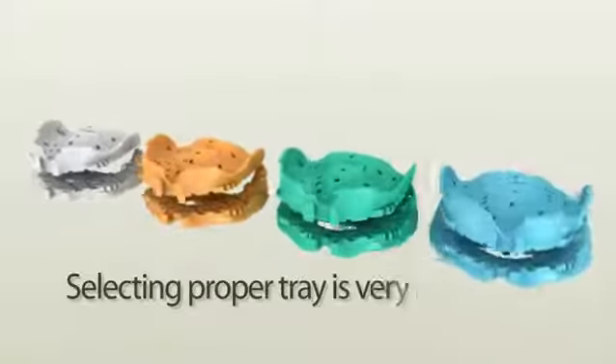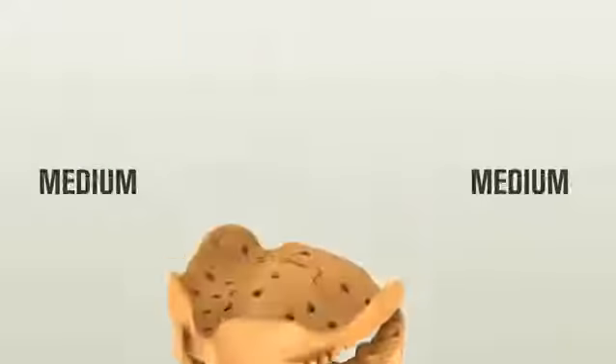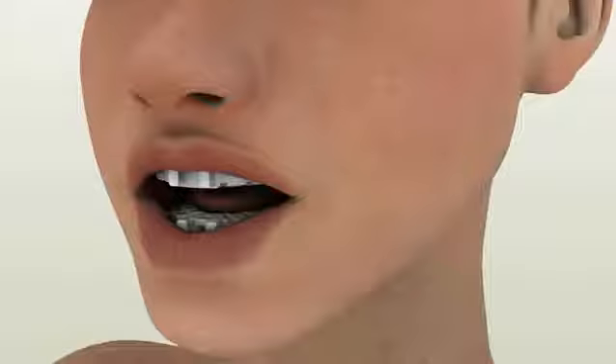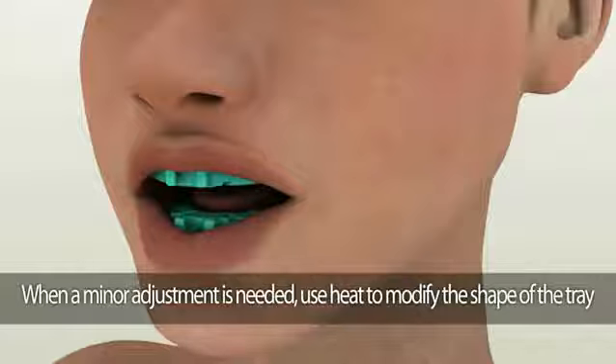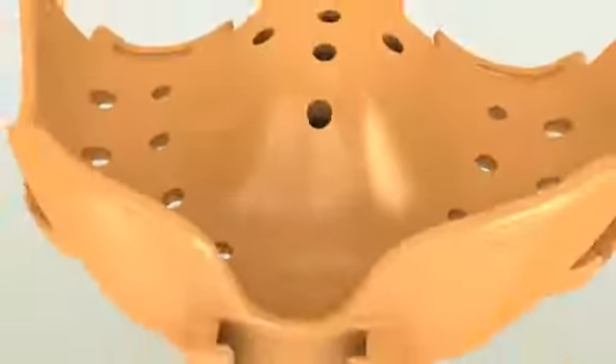Tray selection: selecting the proper tray is very important. Depending on an individual patient's mouth, you can choose from small, medium, large, to extra-large Dent Cut trays. Always verify the tray size in a patient's mouth in case a minor adjustment is needed. Use heat to modify the shape of a Dent Cut tray.